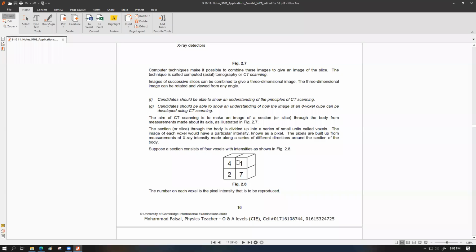We would just know, let's say in this case, just to make the calculation simpler, we are working with 4 voxels over here. I mean, you can stack up with 3 by 4, you can stack up with, let's say, 2000 by 1000. You're going to have a similar kind of calculation. So you can have a much bigger number of voxels with a smaller voxel size, depending upon how precisely you want to scan that patient.